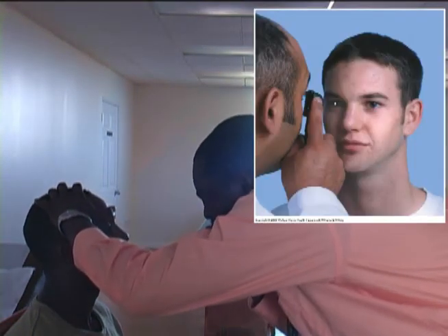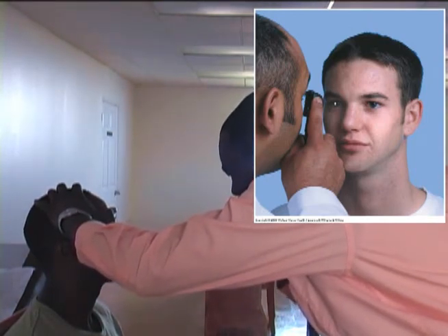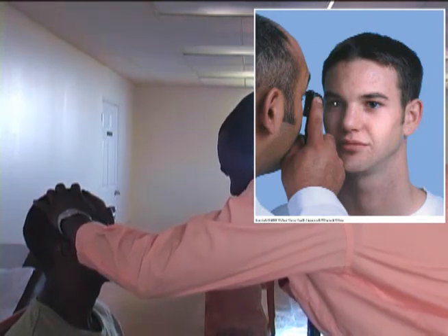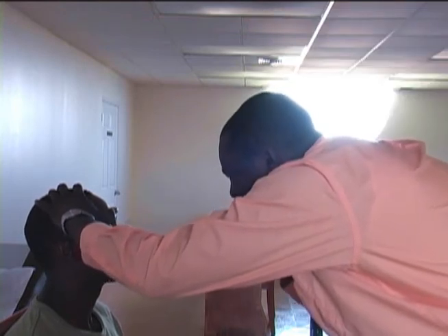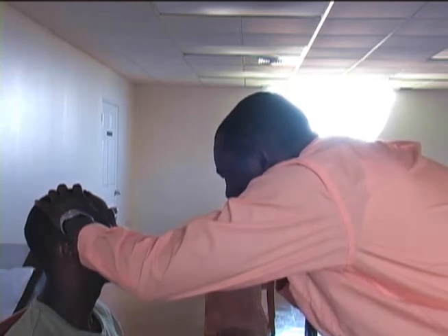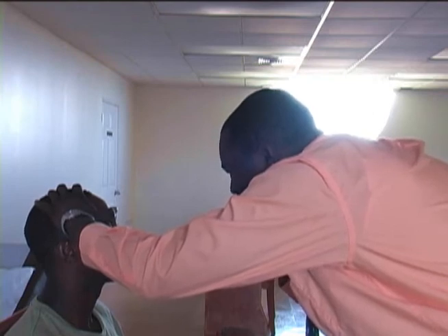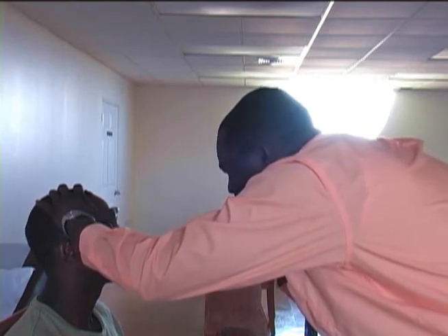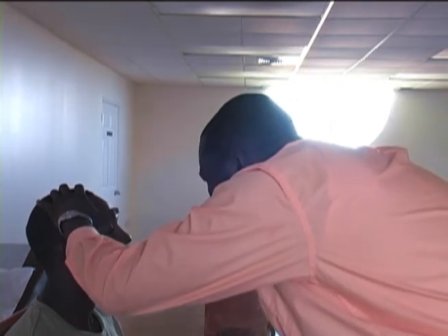Ask your patient to focus on a distant spot over your ipsilateral shoulder and to avoid looking directly at the light. Observe the red reflex in the pupil of the eye to be examined. This will not be seen if the path of the light is obstructed by opacities such as cataract. At an angle of approximately 15 degrees from the sagittal plane, approach the patient at eye level.